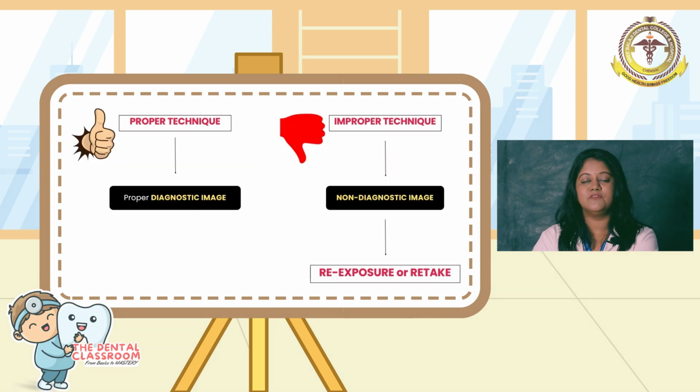Now, only with the proper technique will you be able to capture a proper diagnostic image. If you are not thorough with the technique, then there are going to be errors or artifacts which can lead to a non-diagnostic image and lead to re-exposure or retake of the radiograph.